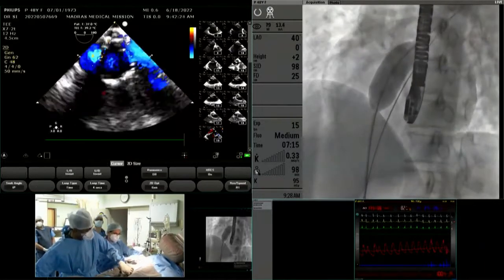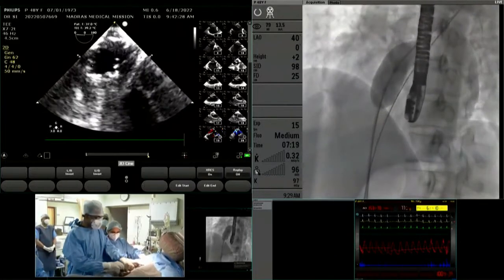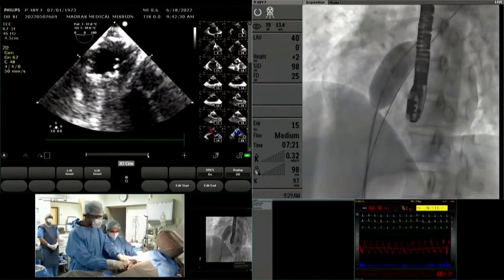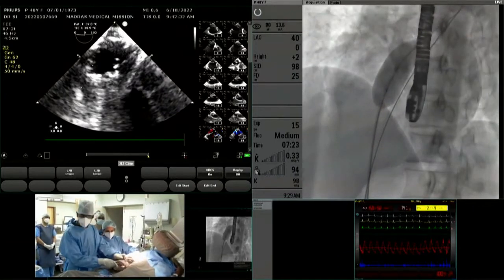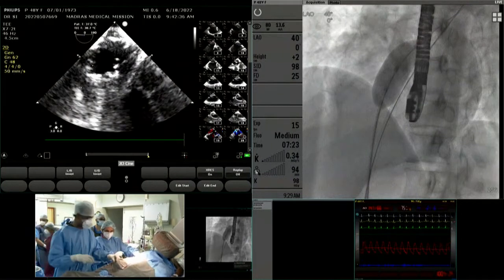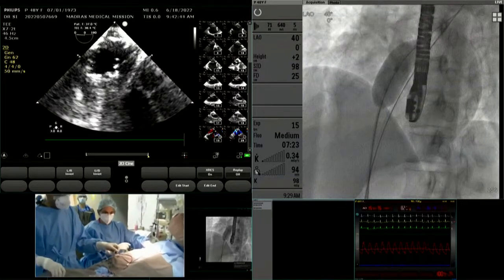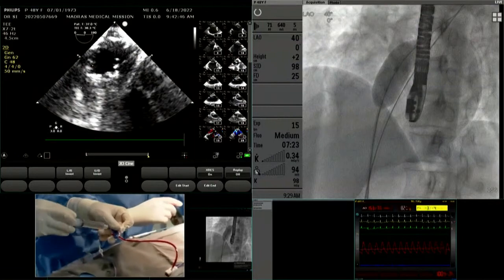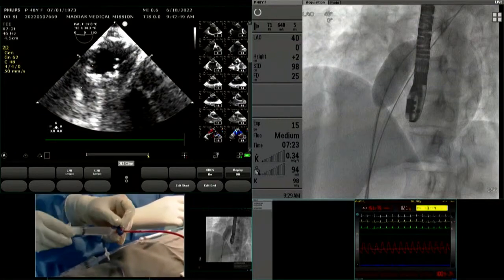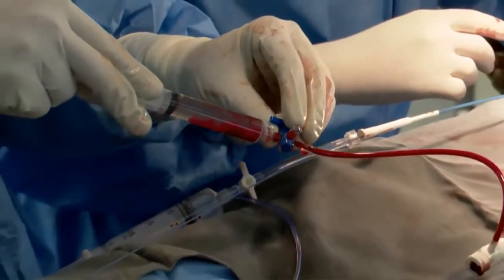We are de-airing the first balloon. Since the patient is on positive pressure ventilation, the chances of air embolism are relatively less in this particular patient than in a patient who is probably on spontaneous breathing. The de-airing, please. The camera bigger screen on the camera come down. Yeah. Fluoroscopy small and hands bigger size. Hands bigger. Yeah. We can see the de-airing.